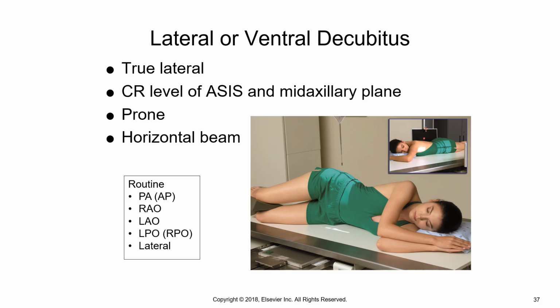After that, we do a lateral rectum. It's a left lateral rectum, and that's on page 531. On this particular image, you are going to collimate to 10 by 12 portrait. Okay, everything else has been pretty much wide open, 14 by 17, either portrait or landscape.